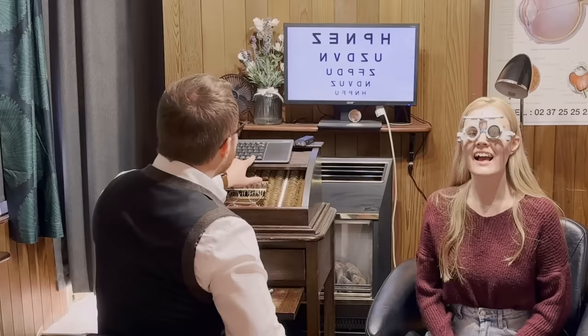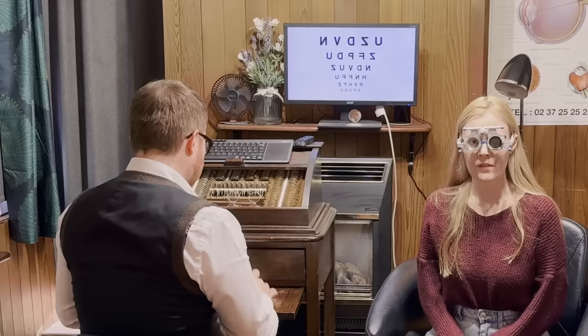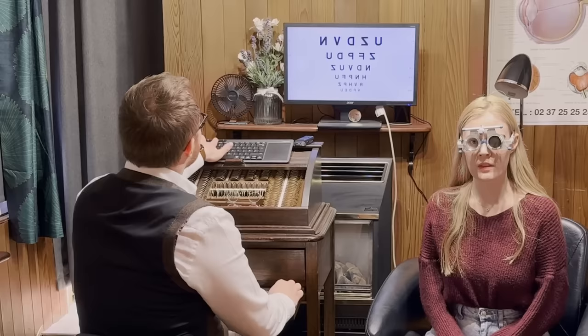Now, as you're looking at the letters there, what's the smallest line that you can get for me? I can read the bottom one. Okay, do you want to read that one out for me? V-F-D-E-U. Brilliant.